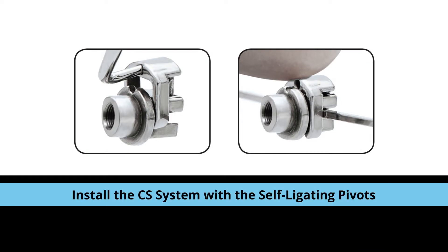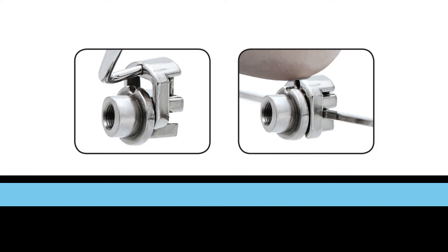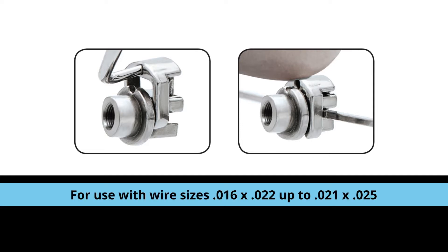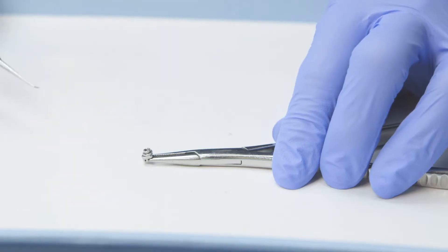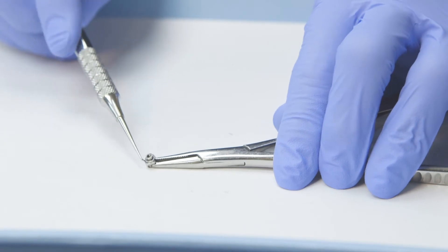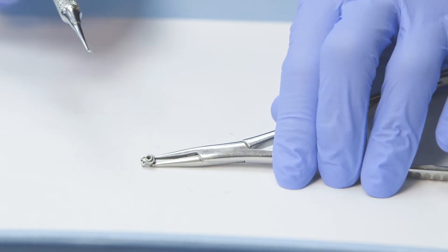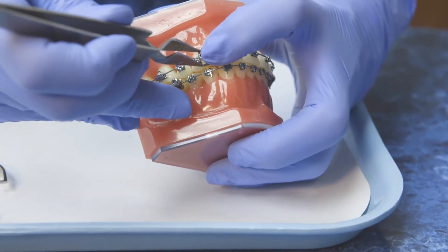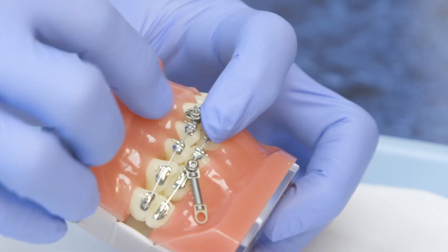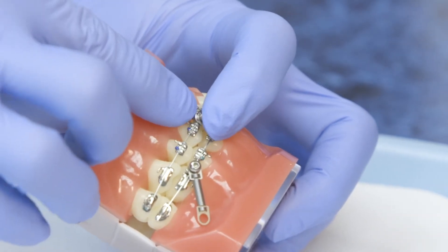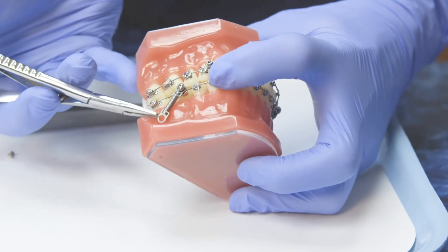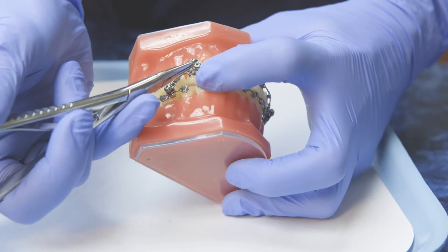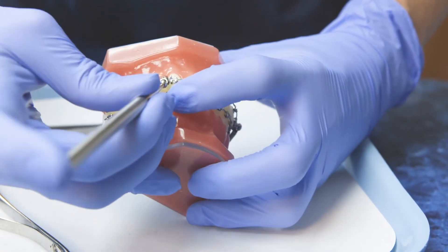Now, let's move on to installing the CS system with the self-ligating pivot. The self-ligating pivots are for use on wire sizes 016 by 022 up to an 021 by 025. Using the self-ligating tool, gently pull the door of the self-ligating pivot into the open position. Place the self-ligating pivot onto the arch wire using your bracket placing tool and close the door using your fingertip by a gentle push. From here, you will simply place the CS springs over the pivot and secure the screw into place using your Allen pencil.